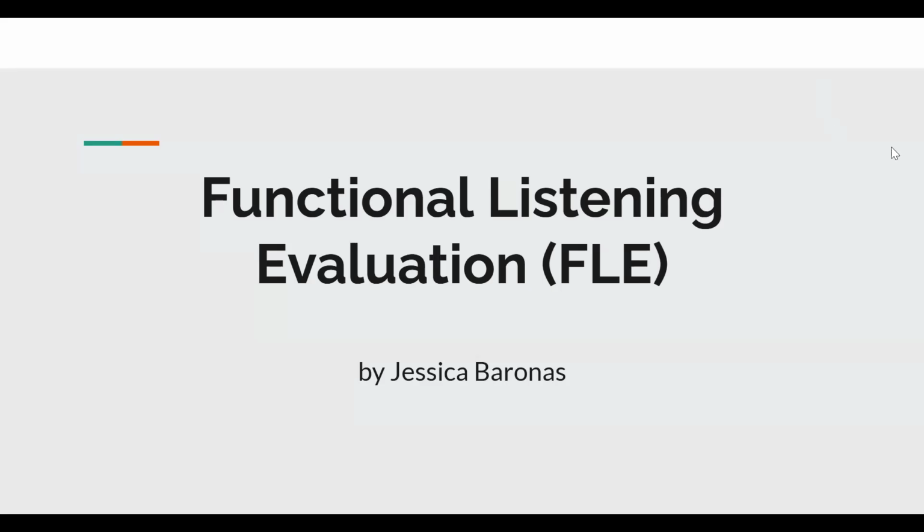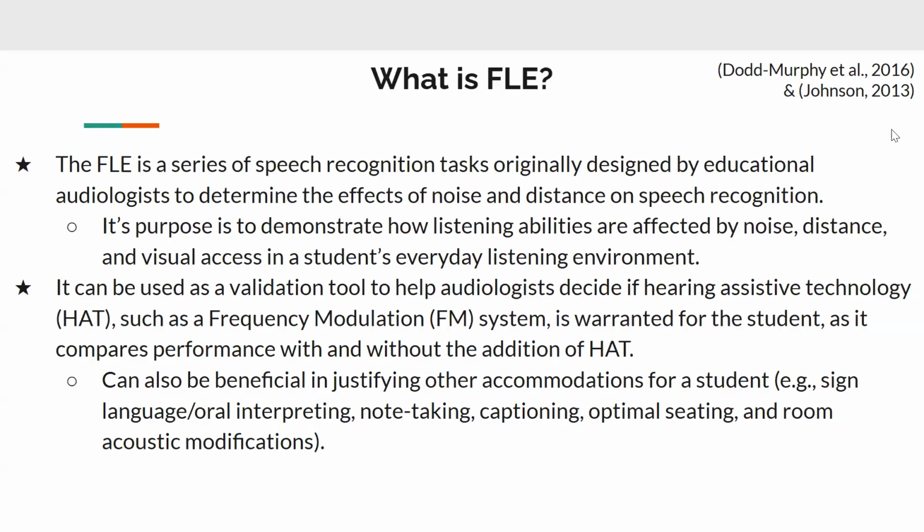So, what is the FLE? The FLE is a series of speech recognition tasks originally designed by educational audiologists to determine the effects of noise and distance on speech recognition. The purpose of the FLE is to demonstrate how listening abilities are affected by noise, distance, and visual access in a student's everyday listening environment.